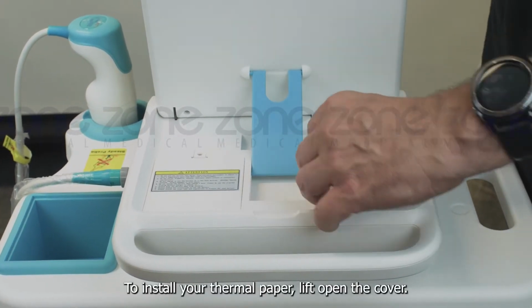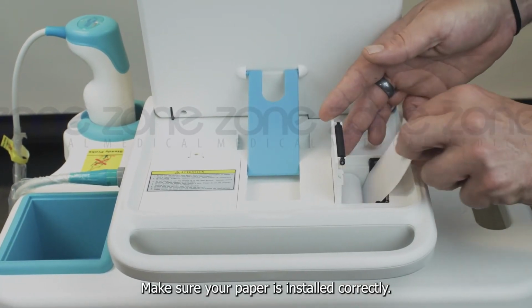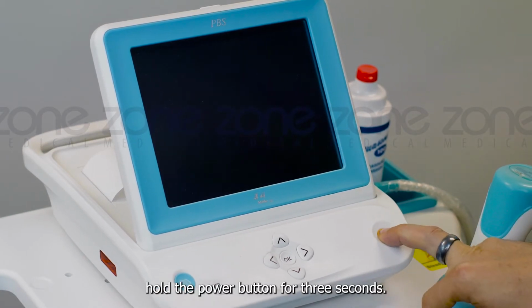To install your thermal paper, lift open the cover. Make sure your paper is installed correctly. To turn on your Bladder scanner, hold the power button for 3 seconds.